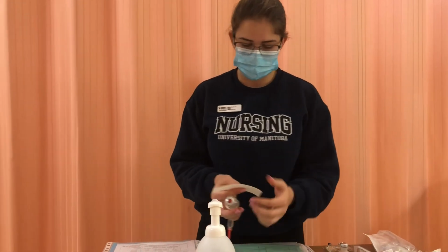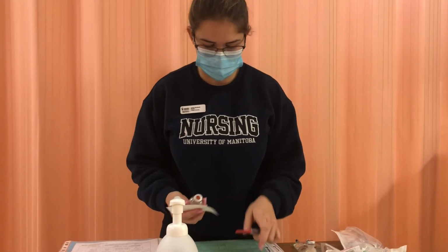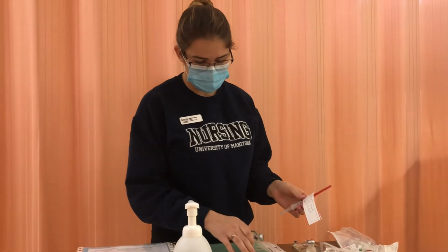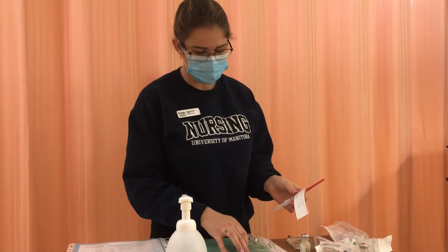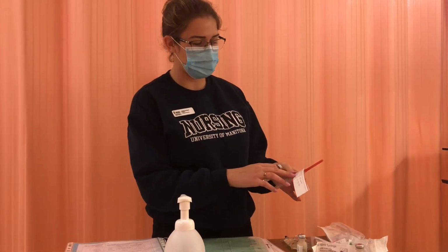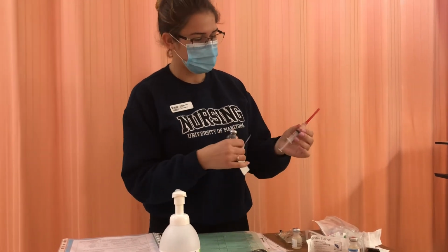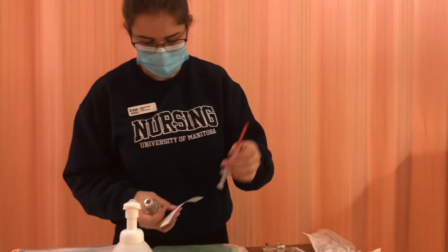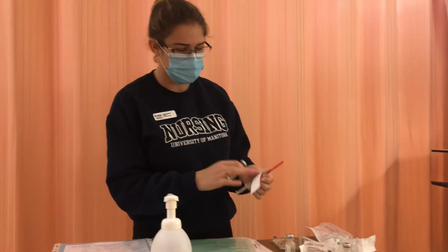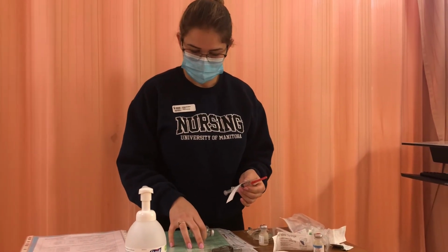So I have Emma Wrightson. Emma Wrightson is who this drug is for. So my drug is cloxacillin. So I have cloxacillin here and cloxacillin, and it's in my syringe. So my dose is 750 milligrams, so there was 2,000 milligrams in here. Once I reconstituted, it was 250 milligrams per ml. I drew up 3 mLs in my syringe to get the 750 milligram dose. So there's 3 mLs in my syringe. So then it's an IV route, so it says IV on my bottle, and I will put this into my med bag and that'll go in IV. It's to be given every 4 hours.